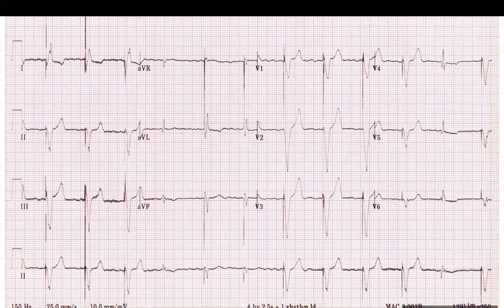So which lead are you talking about? Just to make sure, lead 2 and also V1. It's clear in both of them. So if you're looking at lead 2, there is some atrial activity here. There's a little bit of atrial activity here. It doesn't seem to be organized. But because there is noise, let's move on and go to something else.